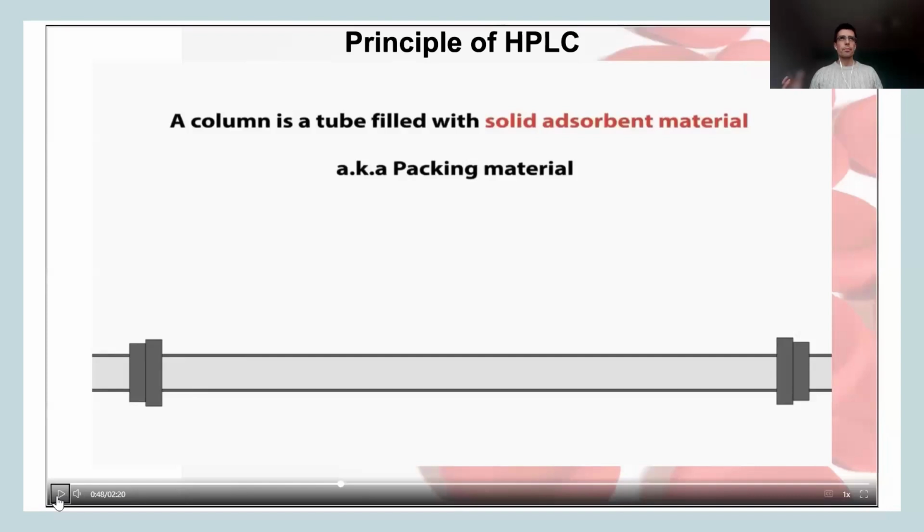So now that we've talked about the mobile phase, the stationary phase: HPLC is used for many molecules, not just hemoglobin. It could be used for molecules much smaller than hemoglobin itself. It all depends on how it is constituted, what is within the cartridge, the column, the stationary phase, all terms explaining the same thing. It is a little bit of a metal piece, inside of which there is some kind of resin or polymer that will be able to target and capture, and that's quite important, capture the molecule of interest.